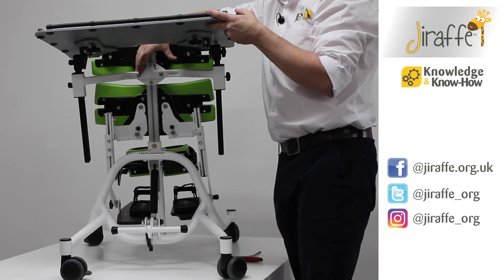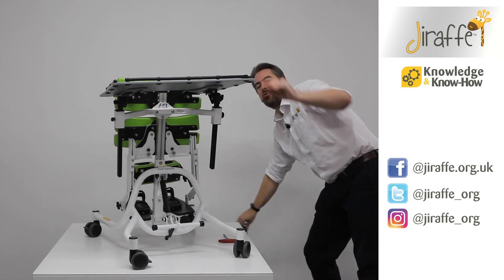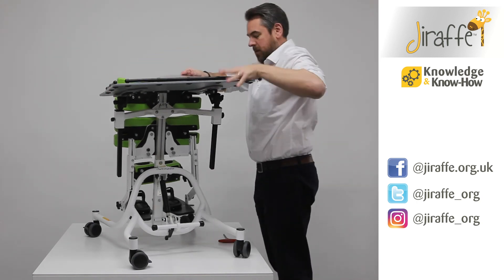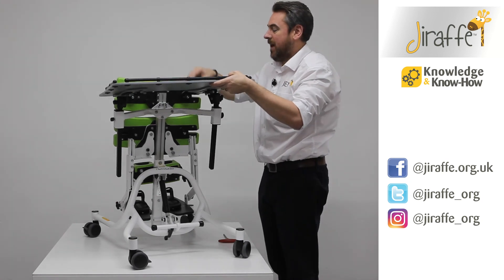What we have now is a gap at the back here — as a child is standing in prone, we could potentially lose their elbows in it. Each tray will come with a grey inlay.